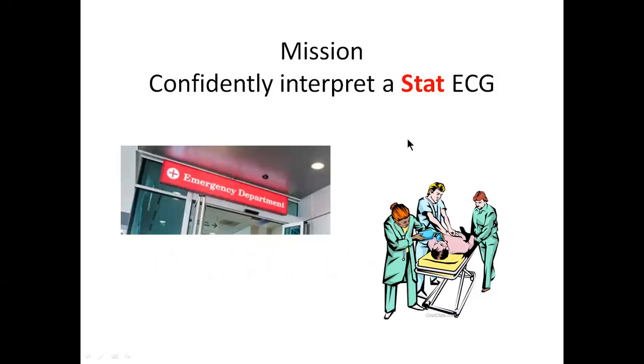So my mission is to teach you to interpret a stat ECG confidently, comprehensively, and real quickly, especially if you had an unstable patient that you had to take care of.